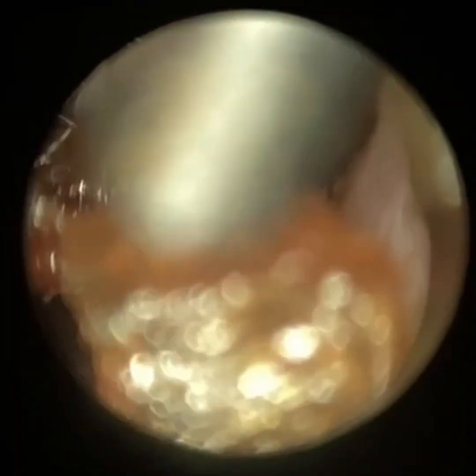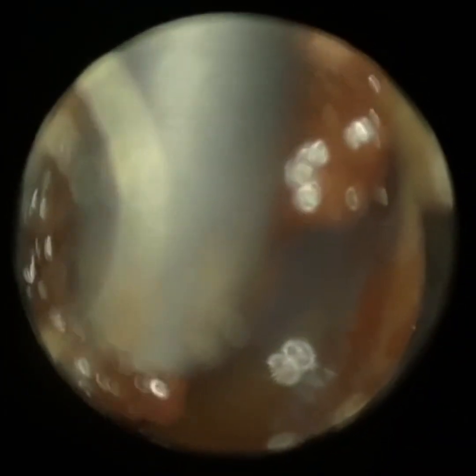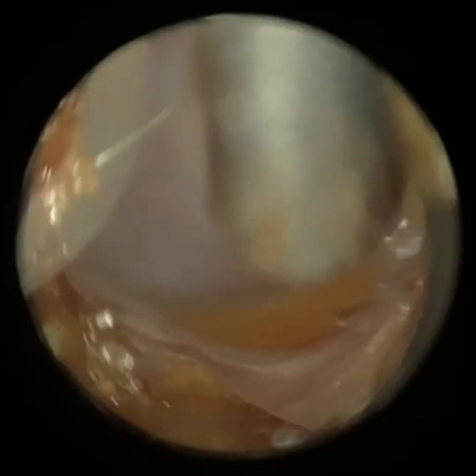He's removed the wax off the eardrum. What he's going to do now is just work all the way around the perimeter of the ear canal. He's going to stretch the ear open in a moment to get access posteriorly. You may notice that the annulus is quite yellow, actually — so this patient may be a bit older. He's going to use the zoom function at the end of the procedure to have a close-up of the eardrum. This is Max working really close to the canal wall, and because of the magnification provided by the Waxscope, he feels comfortable working that close.